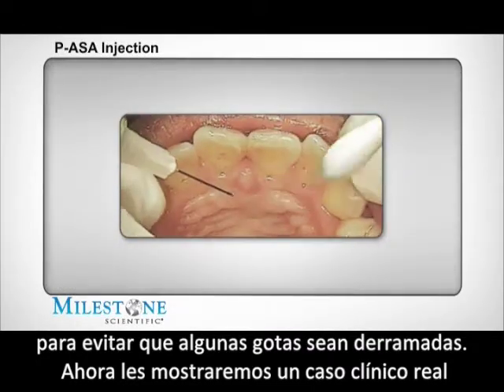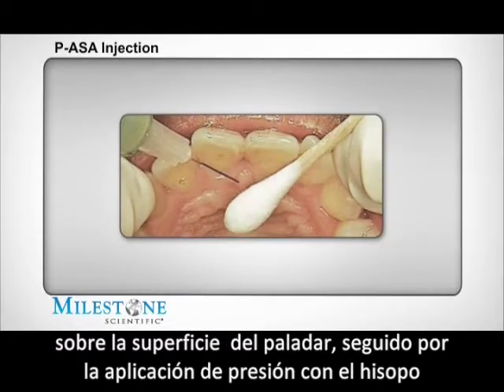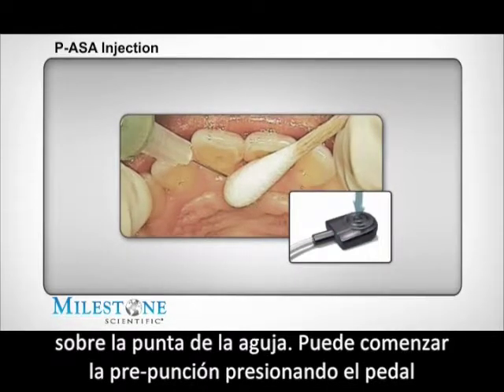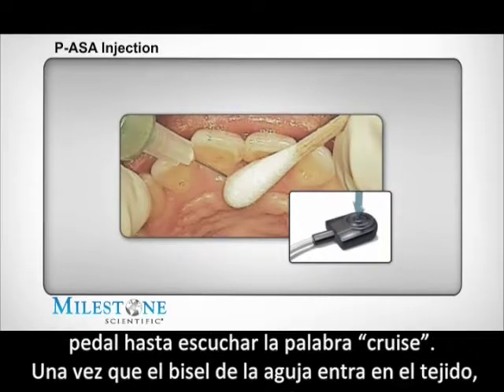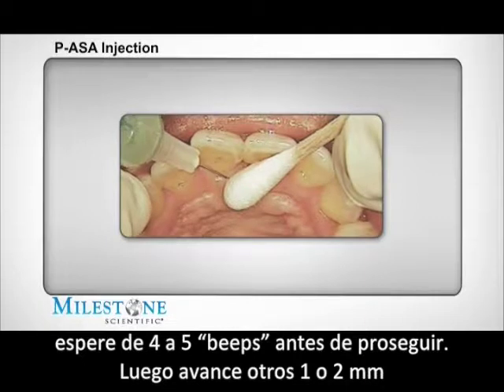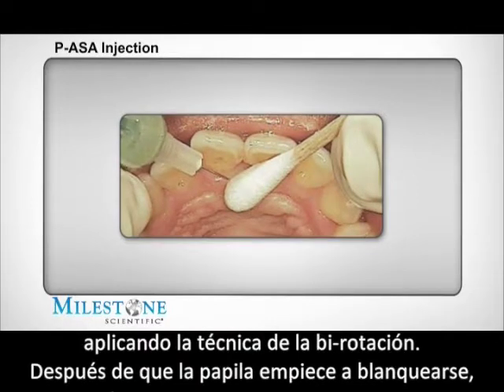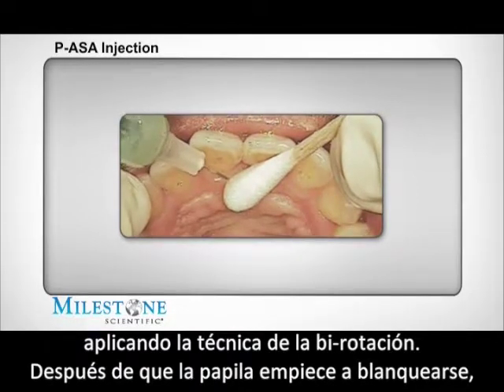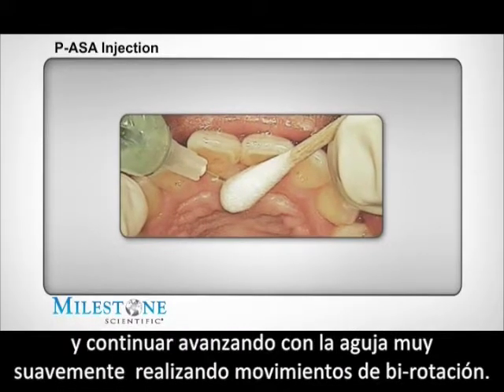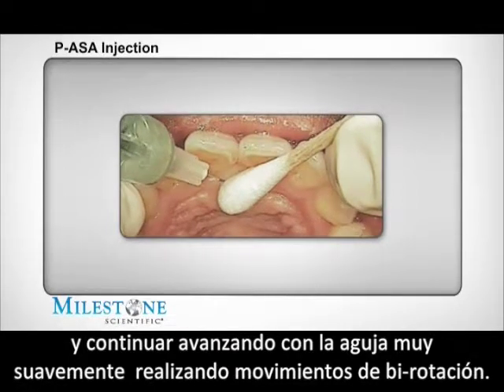We will now show a clinical example of the PASA injection being performed. The needle is applied to the surface of the palate followed by the firm placement of a cotton applicator. The flow of anesthetic is begun by initiating the STA cruise control. Once the needle bevel enters the tissue, pause forward movement for an additional 4-5 beeps before advancing again. Next, simultaneously advance the needle 1-2 mm while rotating back and forth. After the papilla has blanched, reorient the needle more vertically to gain entrance to the nasopalatine canal.